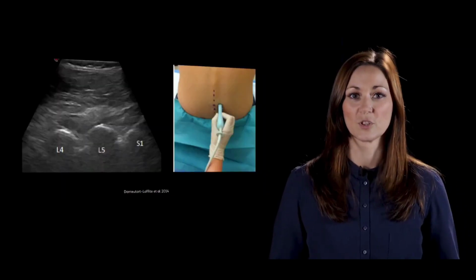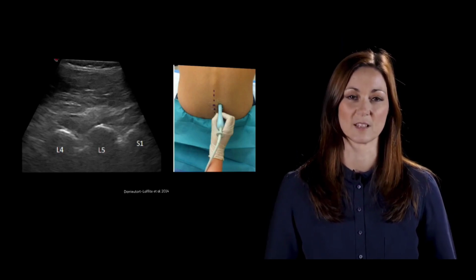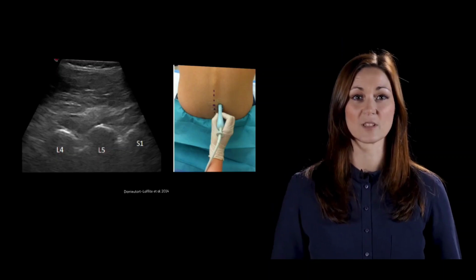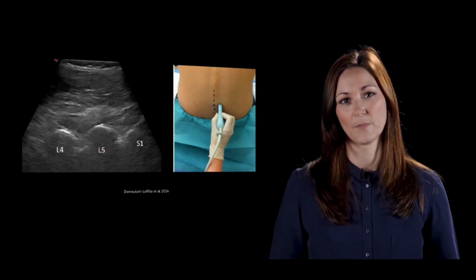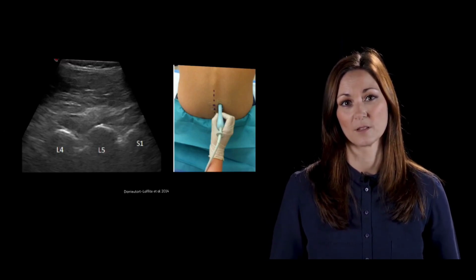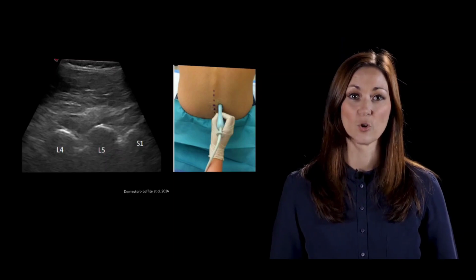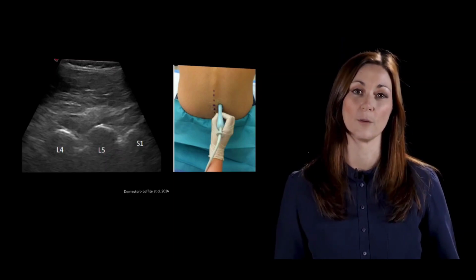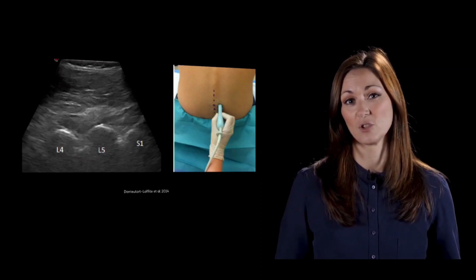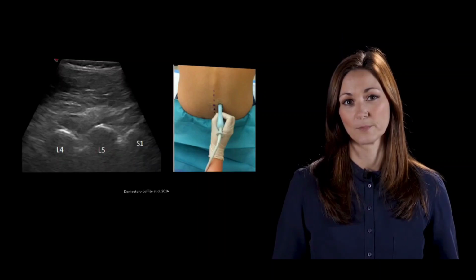The anatomy which you're scanning can affect the diagnostic accuracy due to a difference in complexity. In this slide, you can see a musculoskeletal ultrasound scan of the lumbar multifidus muscle. The levels L4, L5 and S1 can be easily identified. Above these levels, you can see the multifidus muscle, and at the top, the thin, bright white thoracolumbar fascia. Measuring the multifidus muscle thickness is very easy due to its superficial position and the presence of a few clear landmarks.